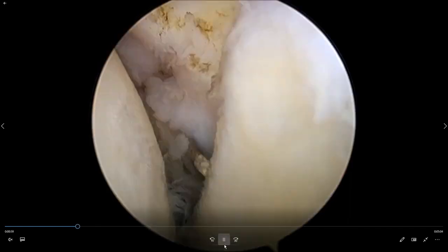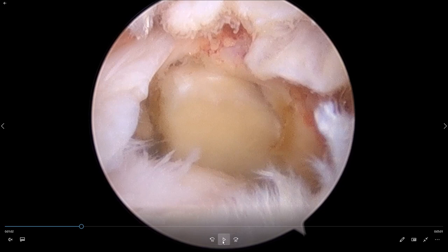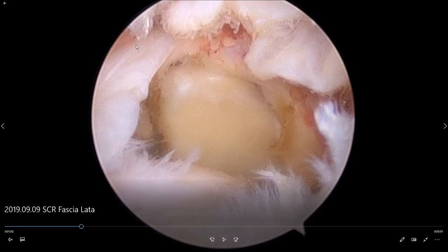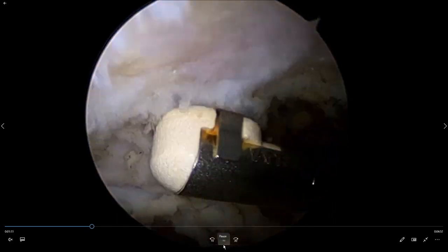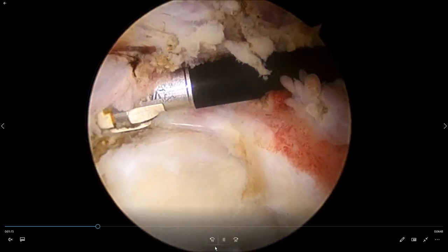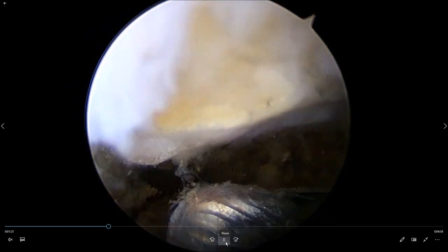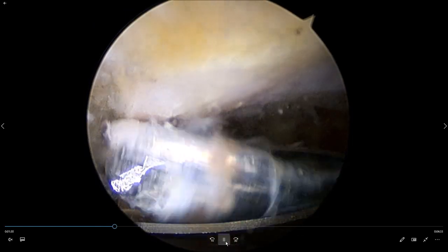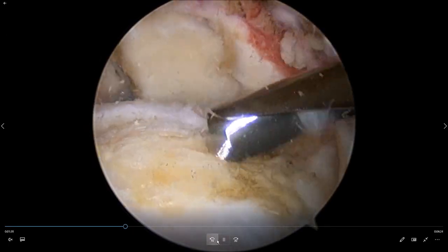We do the decompressions. Dr. Mihata did not cut the biceps — he tried to keep the biceps; that's the difference. He also did not repair side-to-side to the subscapularis; the upper part is actually a lot of the interval. First you need to clean it very well right down to the musculotendinous junction. Cleaning the roof is important. Then do the decompressions — Mihata also does decompressions the same way — and then bony bed preparation, cleaning the tuberosity.